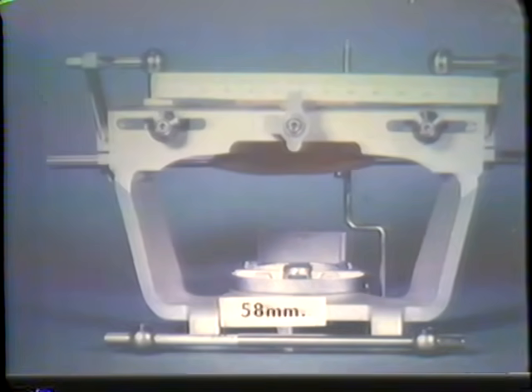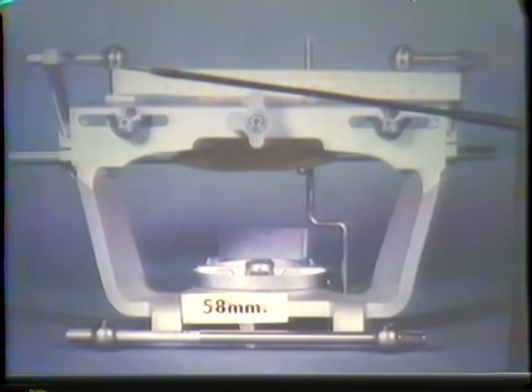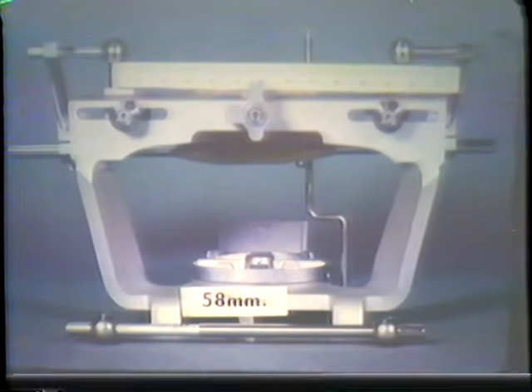as we see here, of course. So this reads 116 from here to about here. Now the facial width is, of course, a bit more. Usually we think of it as 12 to 13 millimeters as far as being the distance from the external facial location that we made with the bow to the lateral border of the condyle. So it comes out to about 116 actually to the center of the condyle, or the center of rotation over here, as far as the calibrated scale that automatically gives you this position.